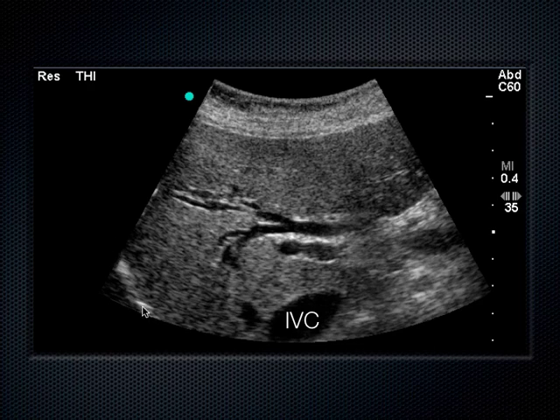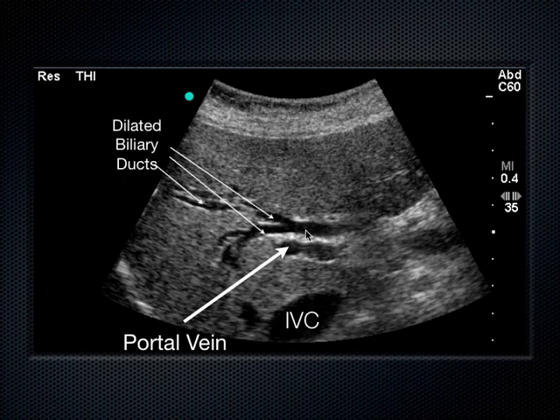That's okay. This stuff will start to take shape. So this is all the liver here. So what vessel is up here, this with the hyperechoic walls? Portal vein. And then what runs anterior to the portal vein? Common bile duct, exactly right. In this case, this patient's got a whole bunch of dilated biliary ducts. You can make out these biliary ducts trying to drain into this dilated common bile duct.